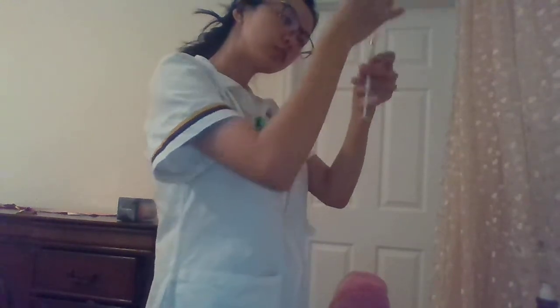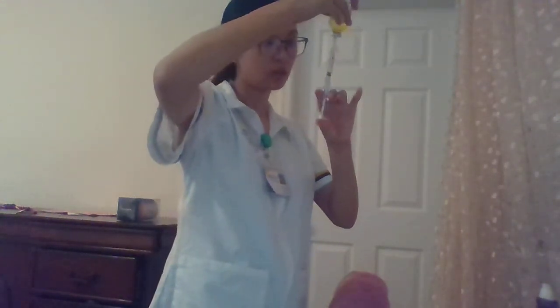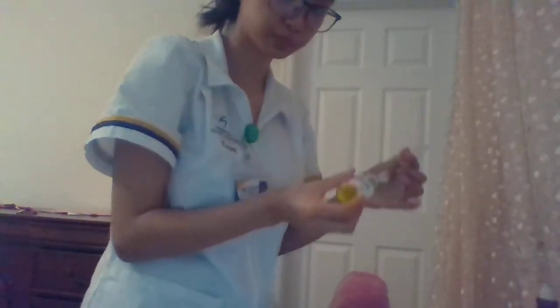And there are some air bubbles, so tap it. I draw a little bit more than 0.5 so I can get rid of the air bubble if I need to. Okay, that's good now.